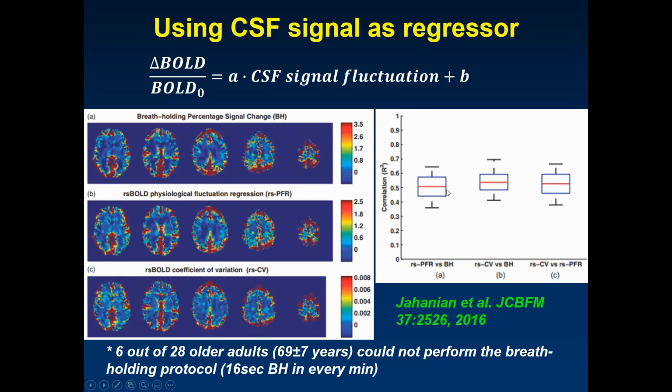They showed that the resting state CVR mapping using CSF signal showed a similar spatial correlation with the breath holding CVR map as our methods.